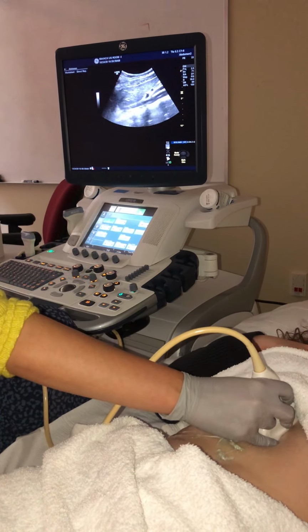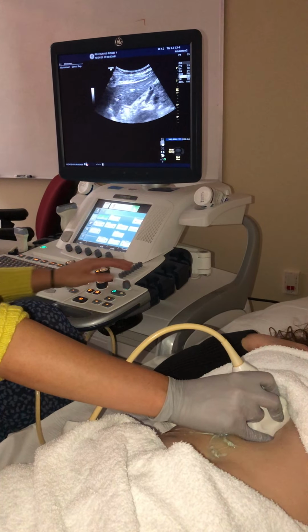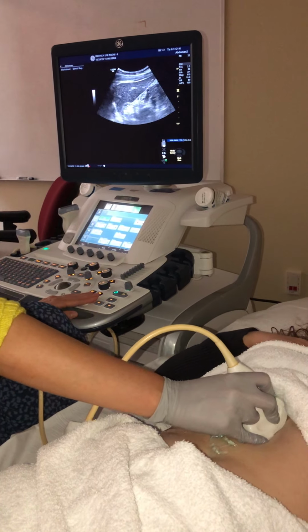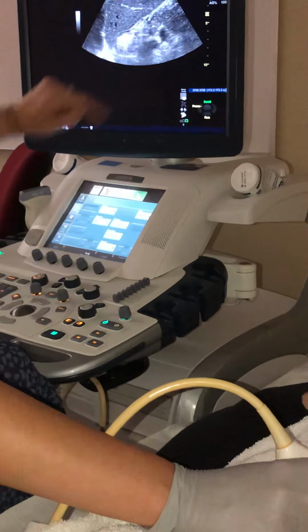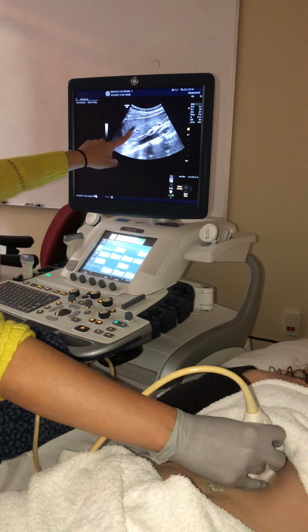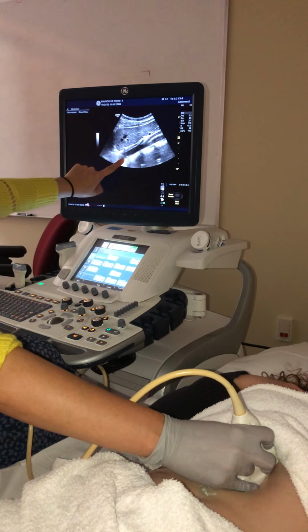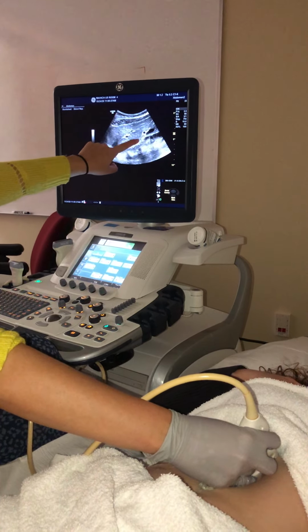So for our images, we would take one like this, showing that triangular band of tissue. Big breath in and hold. Getting our nice triangle piece of sag left lobe. Sweeping in towards her right side, towards the midline. We're going to see our hepatic coming in, but we're also going to see our aorta here posterior to the liver. If we sweep in a little bit more, we're going to see her caudate lobe.